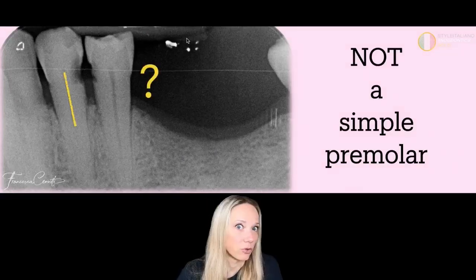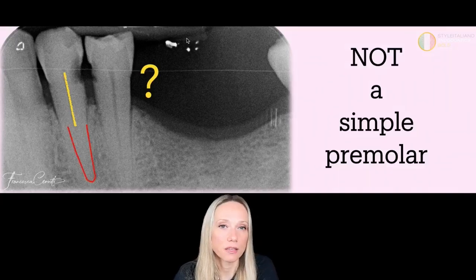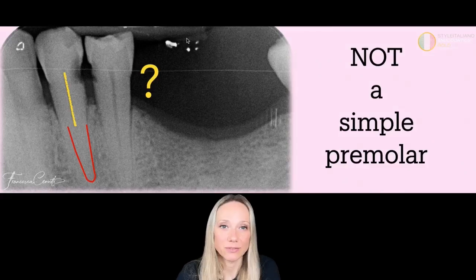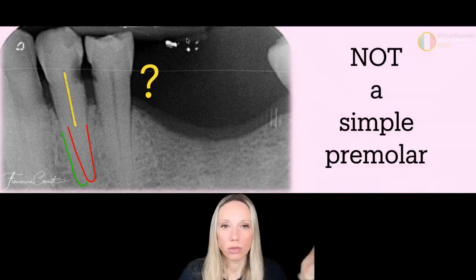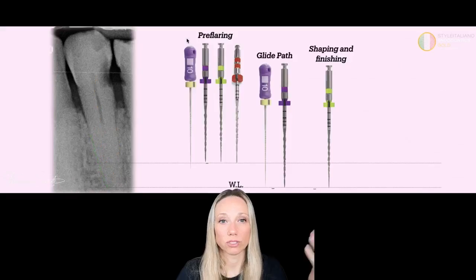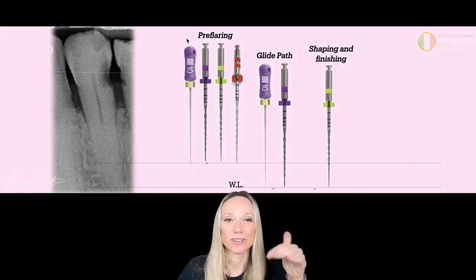Premolars. You know I love premolars. This is not a simple premolar because there is a moment in which the root canal disappears, and so I think that there's going to be something like a split. Yes, there is a split. So how do I treat it? I have no problems in the middle third and in the coronal third because it's a big straight canal. But then I have to be extremely careful in the split.